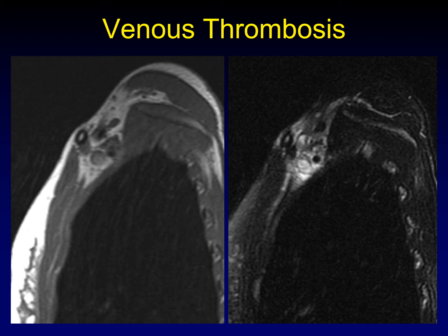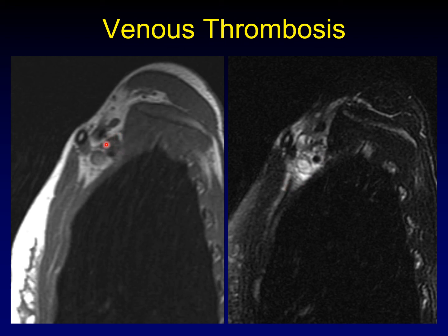Venous thrombosis: on a T1-weighted sequence, there's no flow void in the subclavian vein. MRI is not great at distinguishing slow flow versus occlusion, so be wary of that bright signal. This one is an occluded subclavian vein, and on T2-weighted sequences not only is the vein itself bright, but there's a lot of surrounding inflammation. You might say it looks like a hematoma sitting on the brachial plexus — and usually venous thrombosis comes from trauma with an associated hematoma. Whether it's the hematoma or the venous thrombosis itself, venous thrombosis in and of itself can cause a brachial plexopathy.